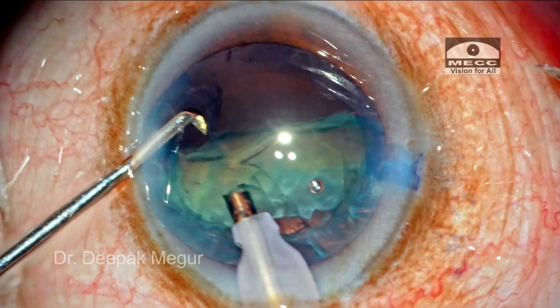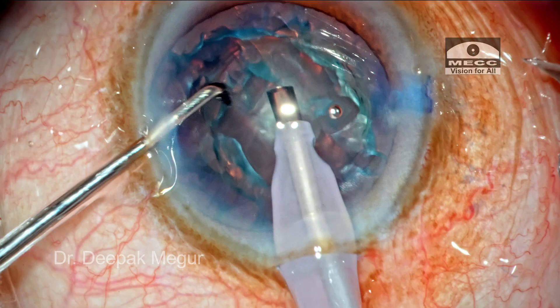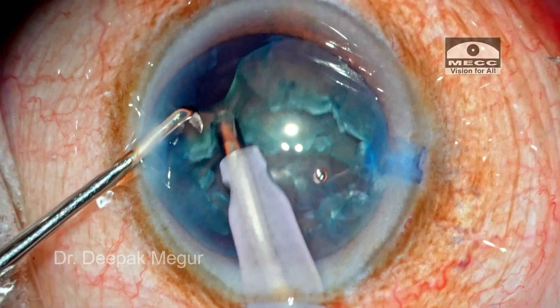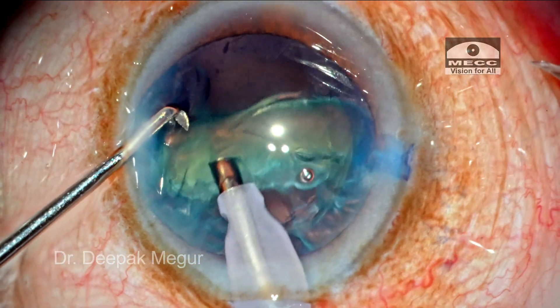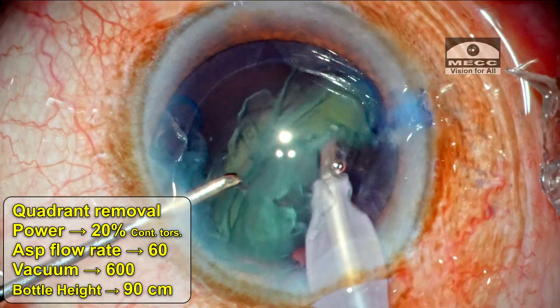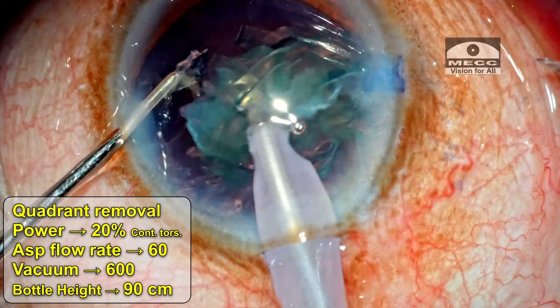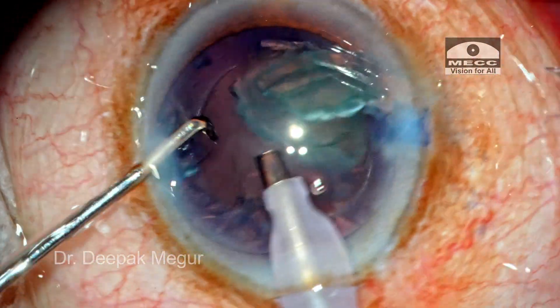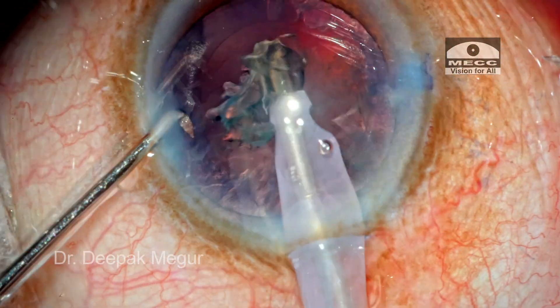Once it's out of the bag, we are in the safe zone and can emulsify it in a jiffy. The idea is to catch the epinucleus anterior leaflet, pull it out of the bag, and then emulsify. We don't want to do any aspiration in the peripheral part of the bag because that's a danger zone — there is a high risk of the phaco tip touching the posterior capsule and breaking it. That's why we engage the nucleus or epinucleus material, pull it to the center, flip it out of the bag, and then emulsify. Now the entire epinucleus and nuclear mass is eaten off.